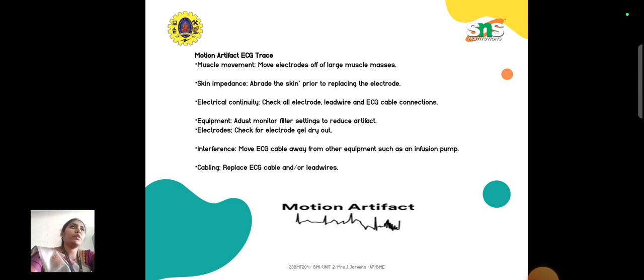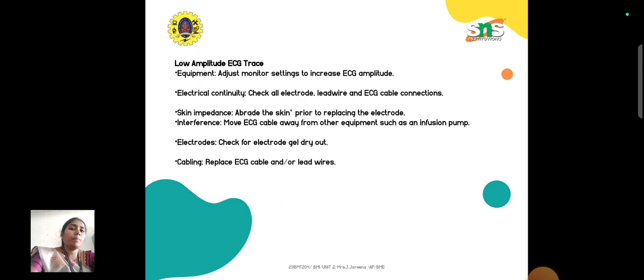We have to give some kind of alternative solution to reduce these motion artifacts by incorporating filters in the design aspects. But outside, we have to ensure that the muscle movement is under control, and check skin impedance changes, electrical continuity, equipment interference, cabling and so on.